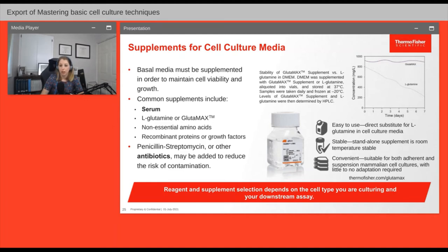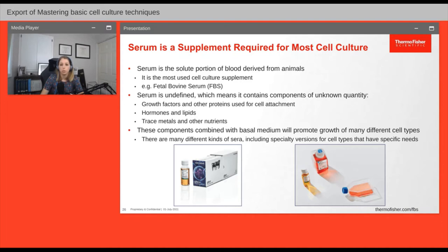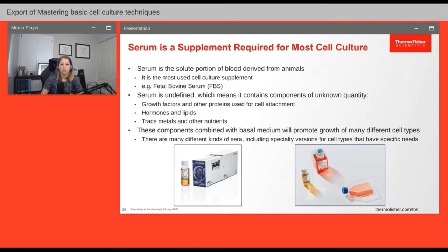You may also want to add antibiotics like penicillin-streptomycin, or pen-strep, to your complete culture medium to reduce the risk of contamination. Serum is the most used cell culture supplement as it contains many growth factors and nutrients. For cancer cell lines I use 10% fetal bovine serum in my culture media. Because serum comes from animals it is considered undefined, meaning it varies batch to batch and can have slightly different percentages of specific growth factors or hormones. For some cell types or experiments this variability may matter, which is why Thermo Fisher has specialty sera validated for specific cell types like stem cells or for specific purposes like hormone studies.